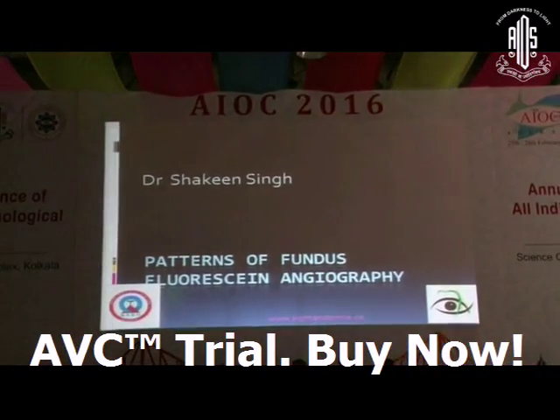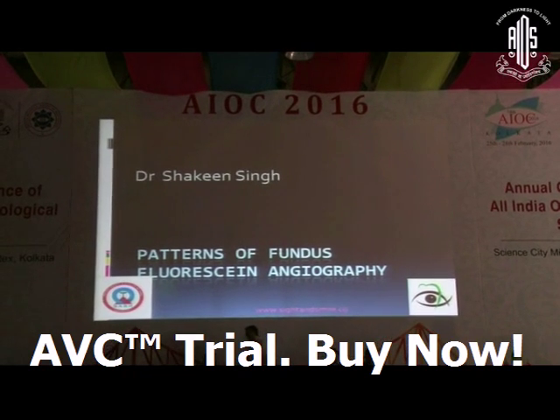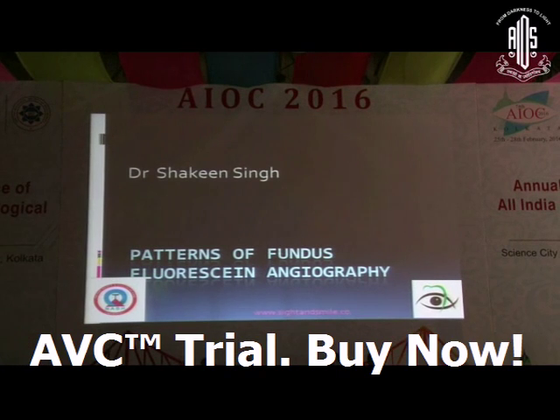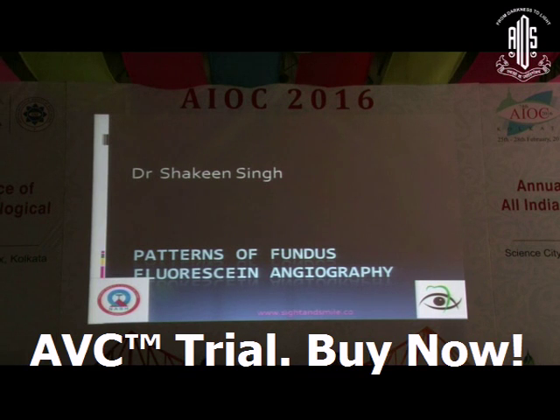Before I start, I would like to add that not only the emergency drugs need to be handy while doing fluorescein angiography. As per the requirement, we should be prepared for CPR and accustomed with it. In case of emergency, we should be ready for all that is required to manage the patient.